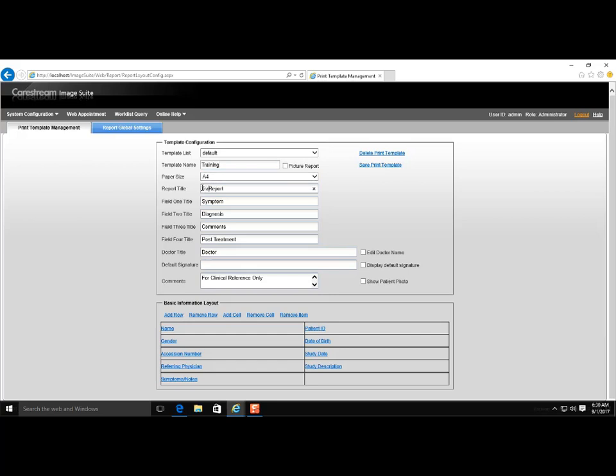To change the default fields, make edits in Field 1 Title through Field 4 Title, or leave them blank. Check the box if you want to include the doctor's name.